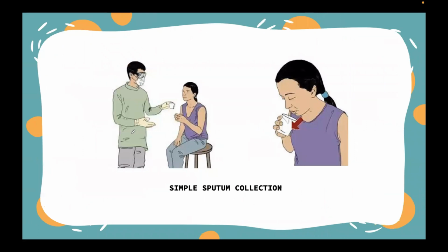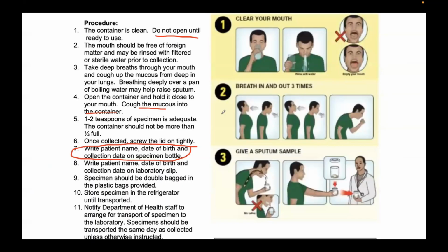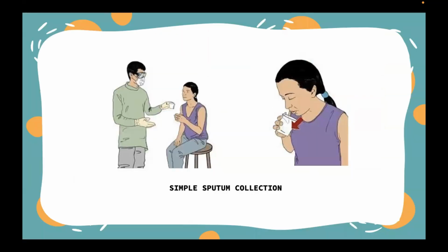So ito po siya, merong proper manner of collection. You have to inform the patient. And then, sabihin mo sa pasyente, huminga siya ng malalim ng 2 to 3 times, tsaka siya mag-expectorate. Para po, sputum talaga yung makolek at hindi saliva.